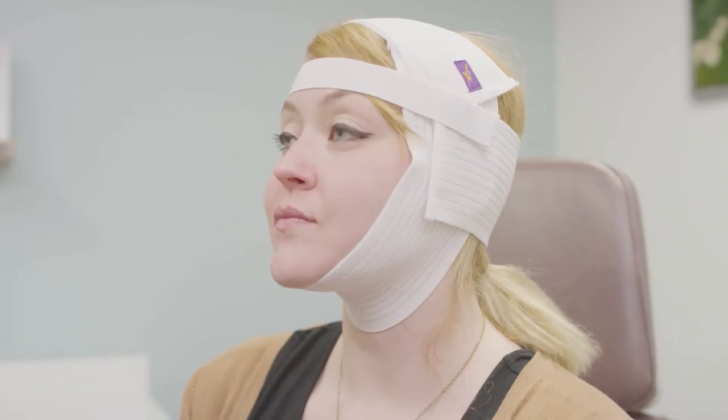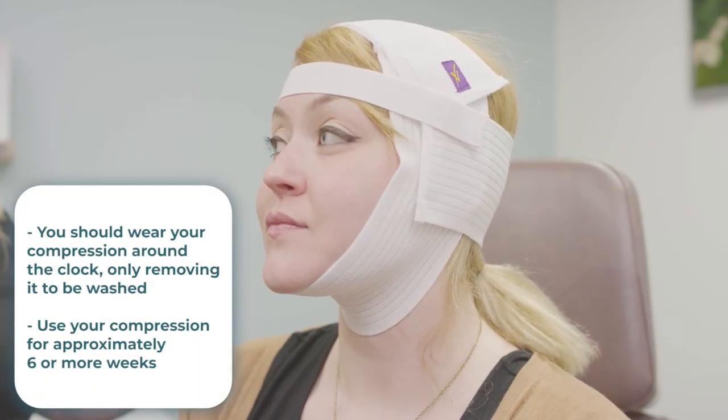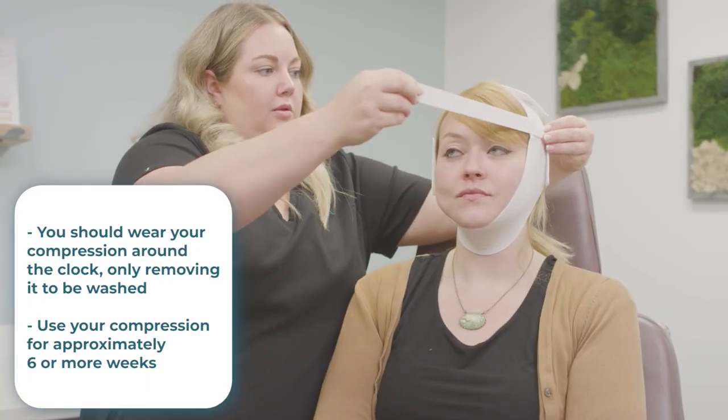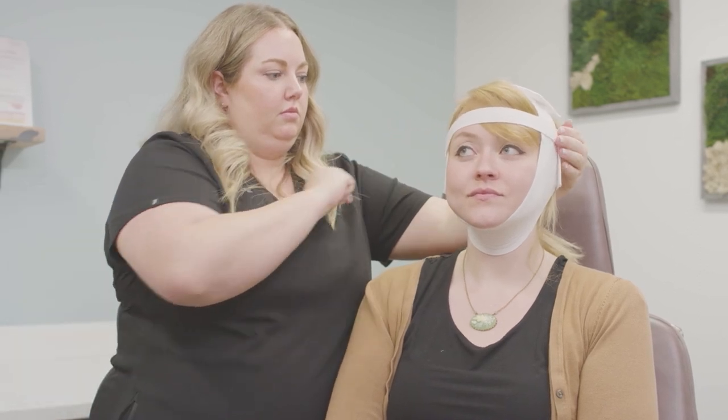Consistent compression is necessary for your face and neck to heal properly, so you should wear your compression around the clock, only removing it to be washed. You should expect to use your compression for approximately six weeks after surgery. You may purchase an additional garment to alternate between if you would like. Please call our office if you have any questions.